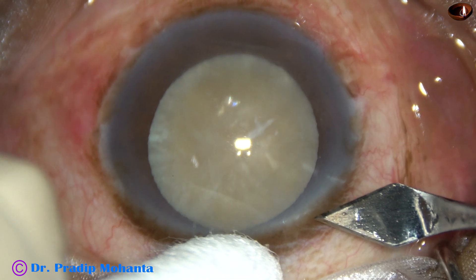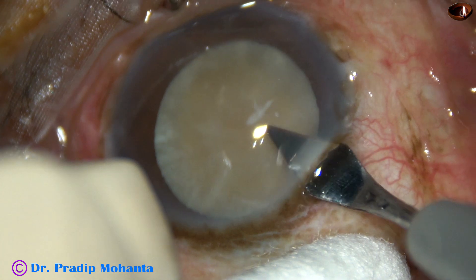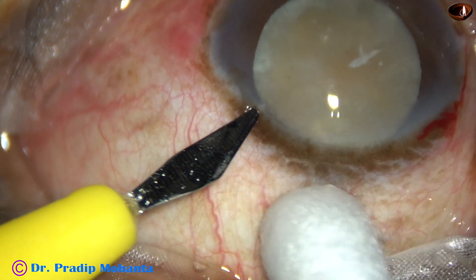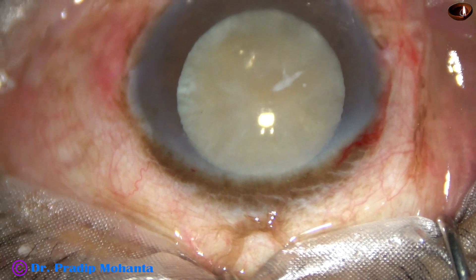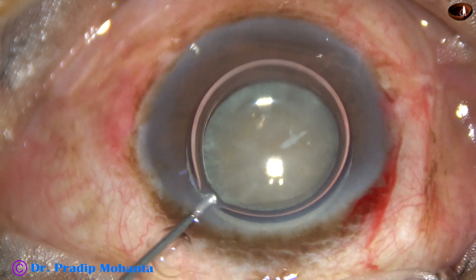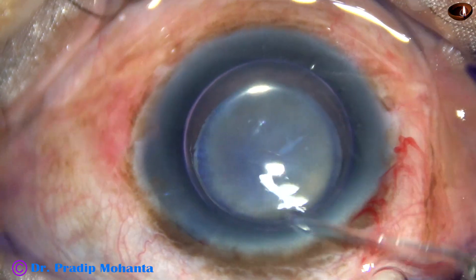This is the main incision at around 135 degrees, around 10:30 o'clock, with a 2.8 millimeter steel keratome. Now this is a sideport on the left side of the main incision. In this case I have made only one sideport. Since the cataract is white, you cannot get any red glow, and I have stained the anterior capsule with trypan blue dye underneath an air bubble.